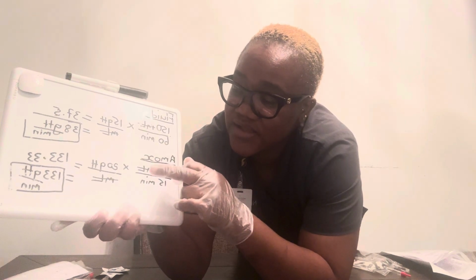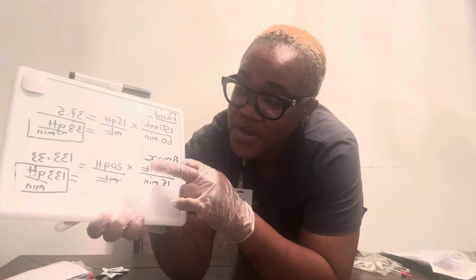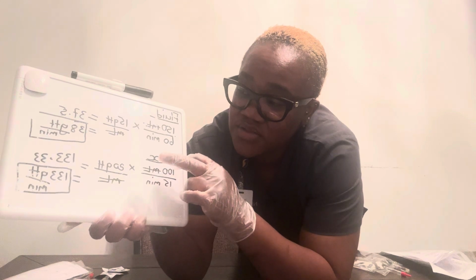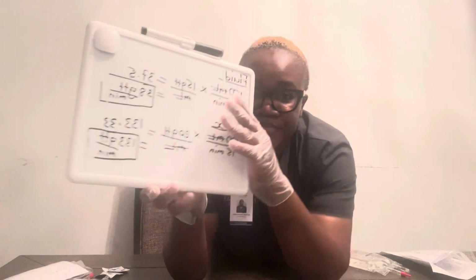And the calculation shows that the infusion rate is going to be 133 drops per minute.